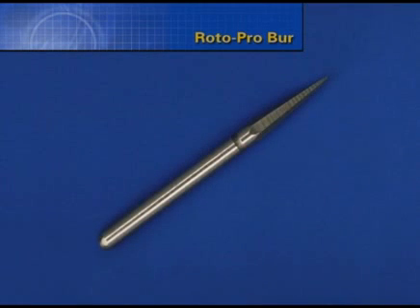Rotosonics is an excellent initial choice to impart energy to loosen and remove some posts. The 6-sided, regular tip RotoPro bur simply inserts into any friction grip handpiece. When the instrument is rotated at 200,000 RPMs, its 6 edges produce 1.2 million vibrations per minute.